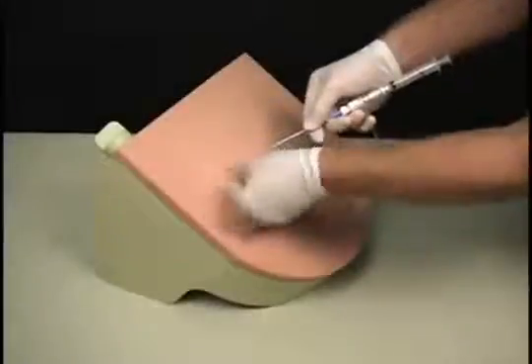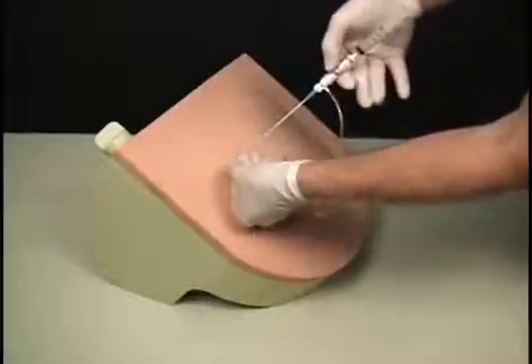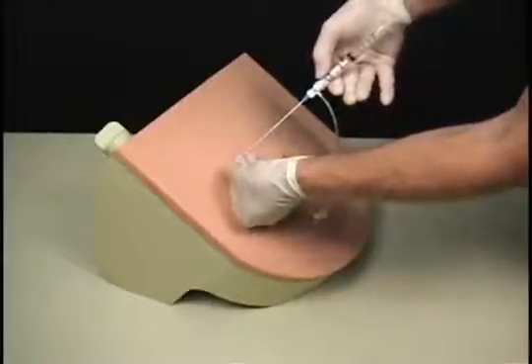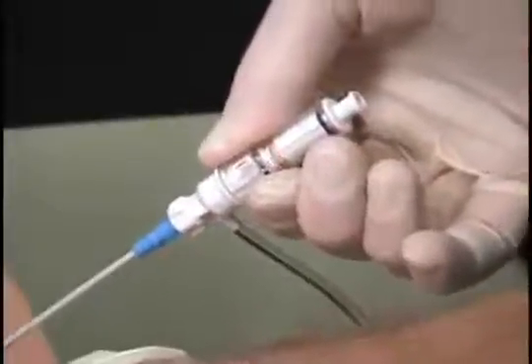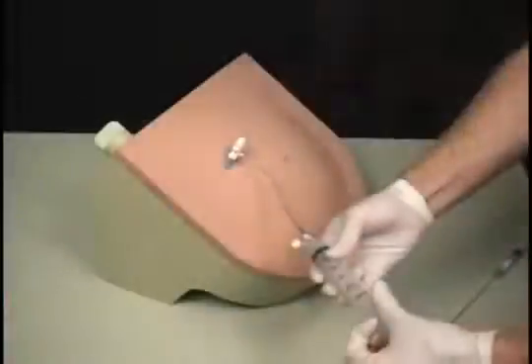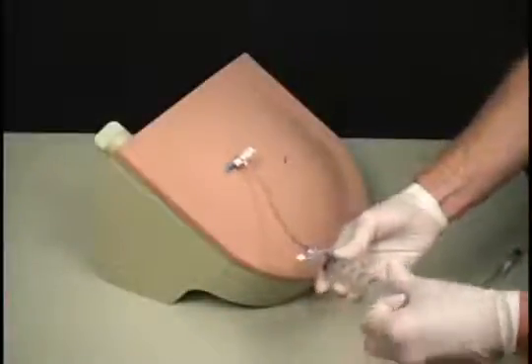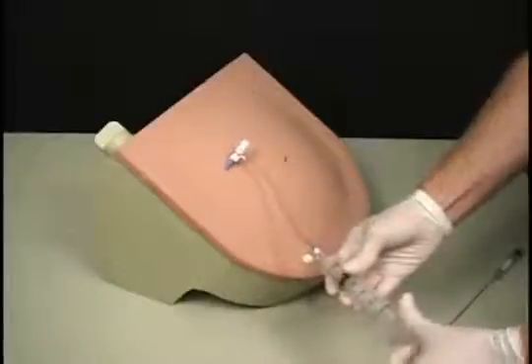During the procedure, a pop will be felt when the abdominal wall is penetrated, and the tissue will respond to the Safety Centesis Catheter Drainage System's Color Safety Indicator. The user will see a positive fluid flow when the fluid is accessed, and up to one liter of ascites can be removed.